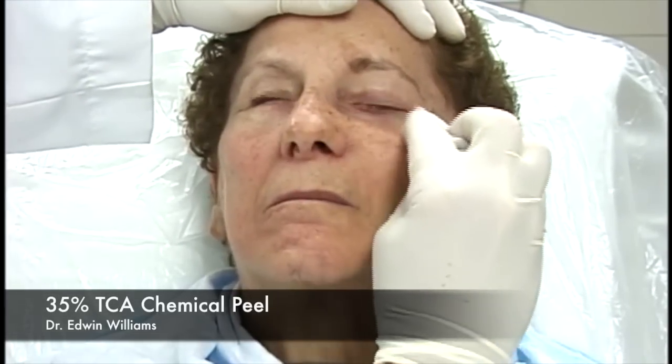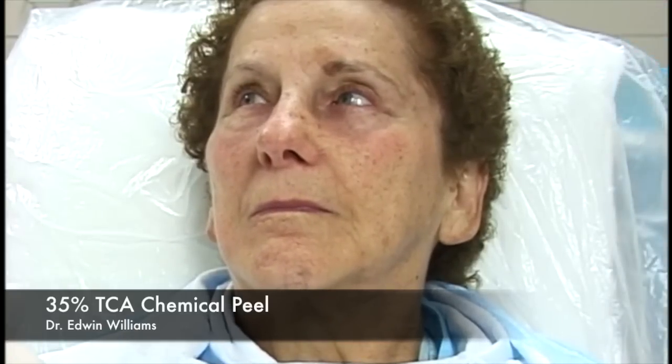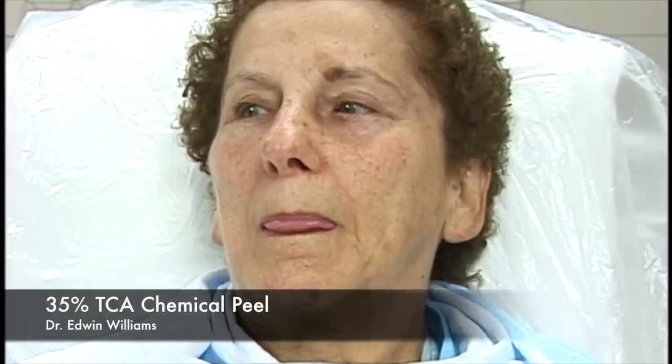Now that the patient is prepped, have her look up for the lower eyelid. The vapors of the acetone are a little irritating. You'll notice when we use the fan, we try to blow across the patient's face—not directly into the patient's face, which would stimulate tearing. Any time we're done with something on the patient, it goes right into the garbage pail; we don't put it back on the prep stand so we don't inadvertently pick up the wrong item.